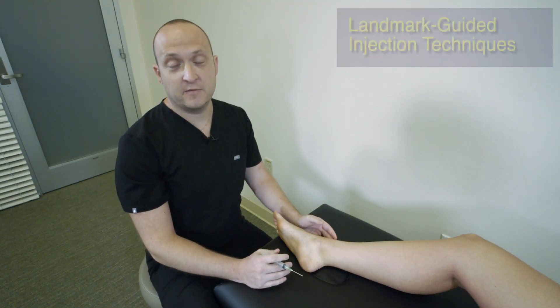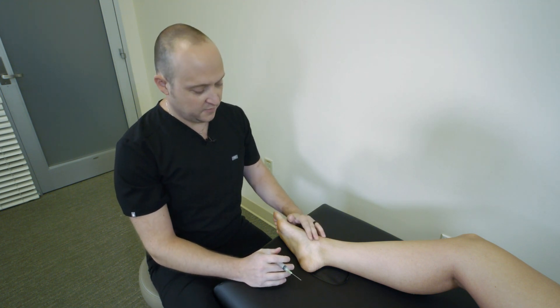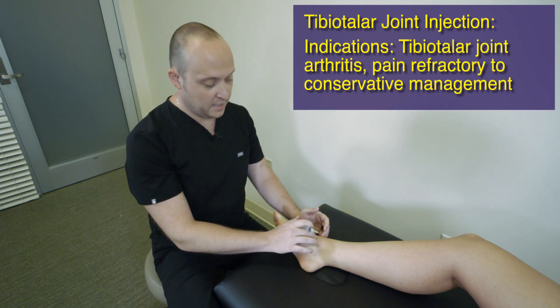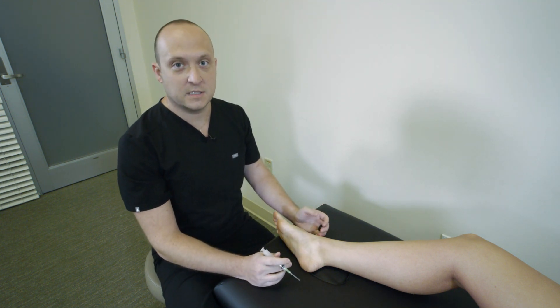As we finish up our video series, we're going to cover the common injections for the foot and ankle that you may see in your practice. The first one is the tibiotalar proper ankle joint injection. This can be done under landmark by both an anterior medial and an anterior lateral approach, but we're going to be showing the anterior medial — it's a little bit more accessible.